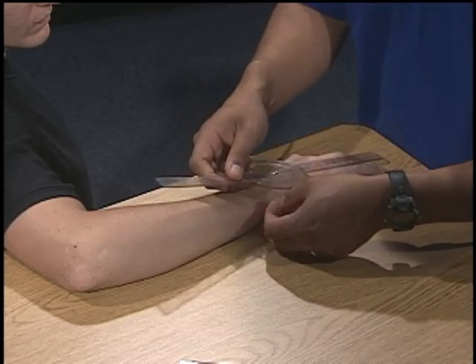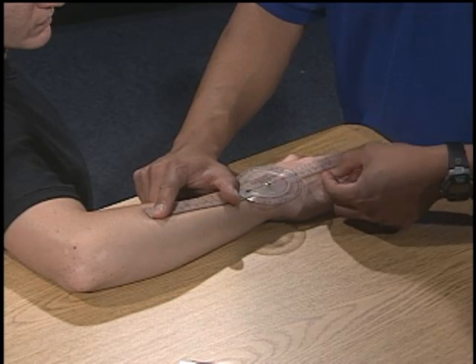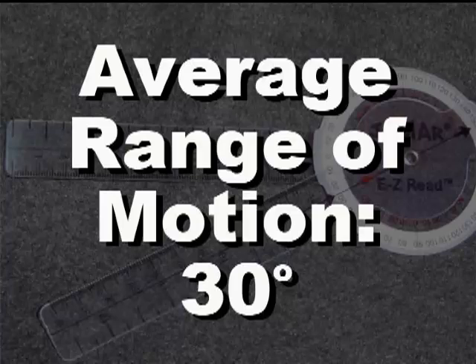Measure twice. If the measurements are off by greater than 5 degrees, take a third measurement. Take the average of the measurements and document it in the patient's chart. Average range of motion according to the American Academy of Orthopaedic Surgeons is 30 degrees.